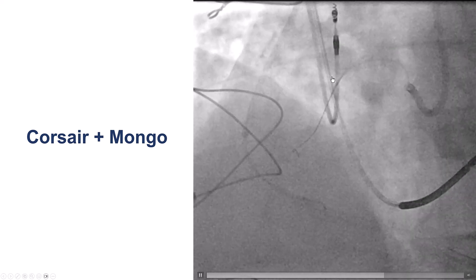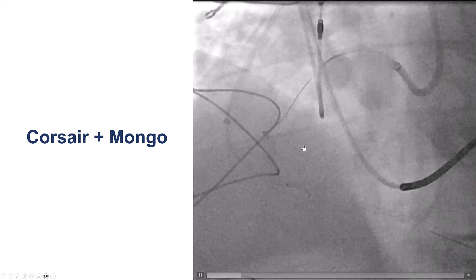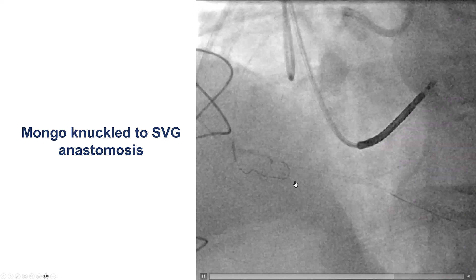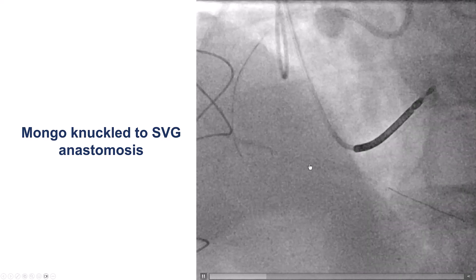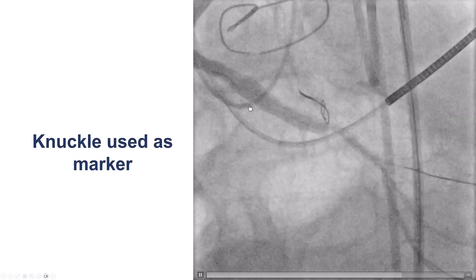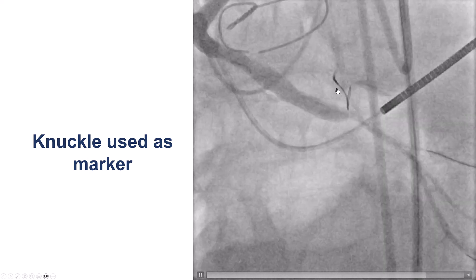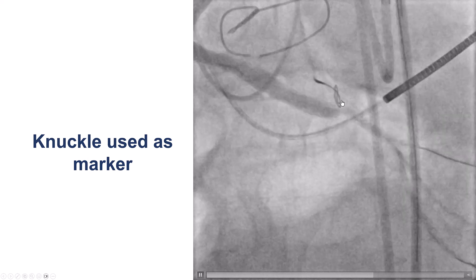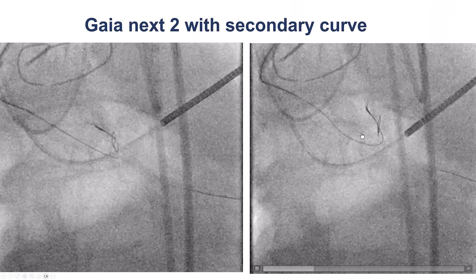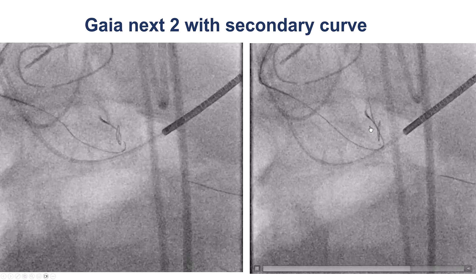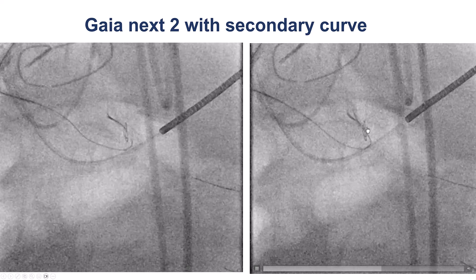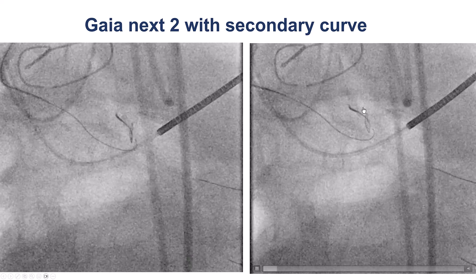We used a Corsair microcatheter and a Gladius Mongo that was knuckled, and the Mongo advanced well down the right coronary artery all the way to the SVG anastomosis. This was very useful because now we had a marker showing where the native vessel was in relationship to the saphenous vein graft. We then used the knuckled guide wire as a marker for our retrograde equipment. We tried a Gaia Next 2 guide wire, which advanced along the course of the right coronary artery, and that clarification of the distal cap through the knuckle was very useful for retrograde wire crossing.